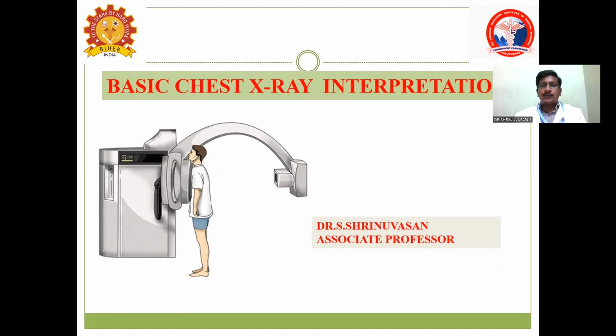So now I'm going to take classes on basic chest X-ray interpretation. I am a doctor in the radiology department, working for more than 8 years. Now I'm going to talk about how to read the chest X-ray. Chest X-ray is a basic fundamental thing, so every doctor should know how to read it. We are going to see what an X-ray and a chest X-ray are, what the different views are, and how we have to interpret chest X-ray abnormal and normal findings.